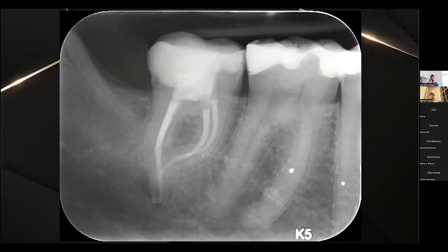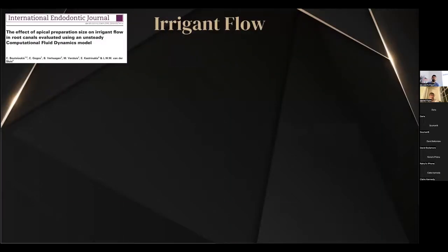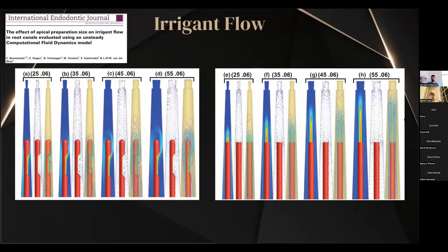Again, the reason that we would use these sort of wider tapered preps is that back then we were limited to the type of irrigation devices that we had. These traditional metal syringes, the traditional metal irrigation needles, weren't very flexible. So, same as your pluggers, you needed the wider preps to get your irrigant into those canals.